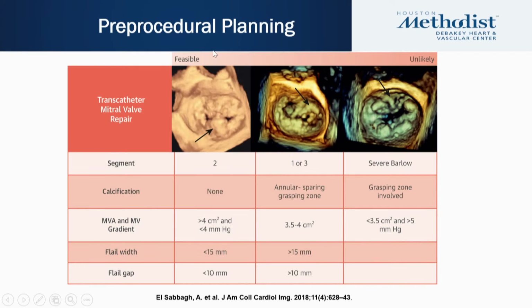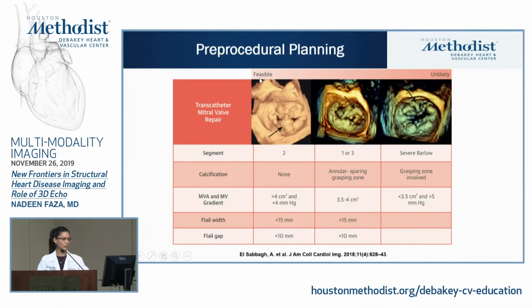Let's talk about mitral valve repair with the mitral clip. Again, why is the use of 3D echocardiography key in pre-procedural planning? This is a table from JACC Imaging, published last year, and it tells you what the most feasible anatomies are for a mitral repair, and what are the more challenging anatomies. And it's all based on 2D and 3D imaging.